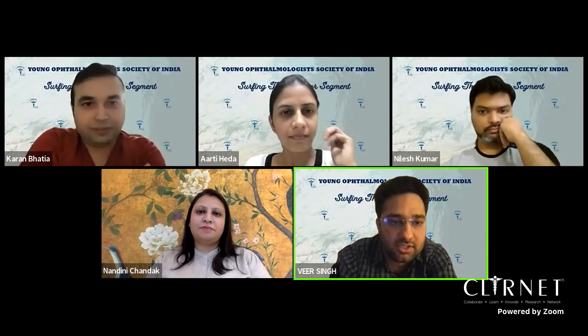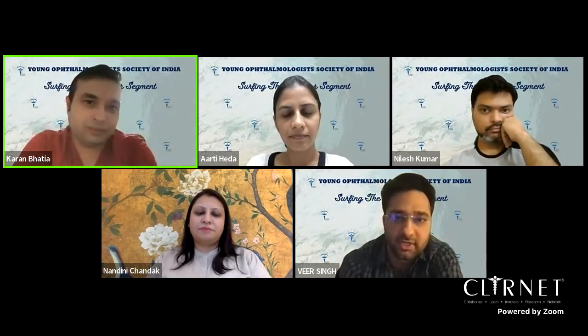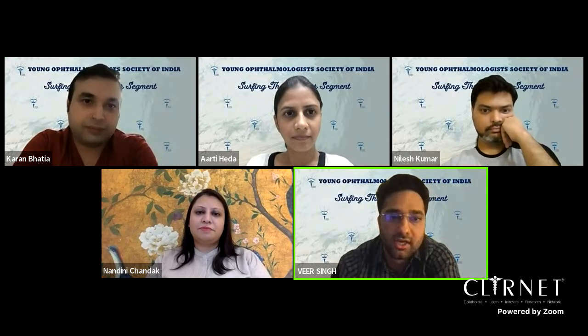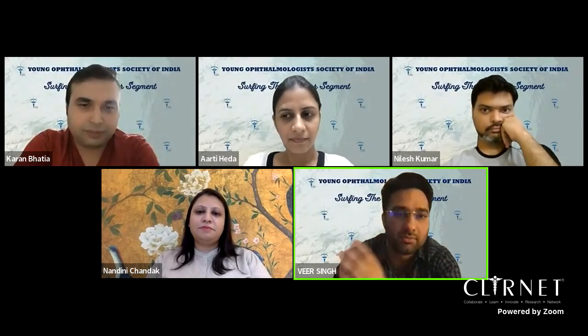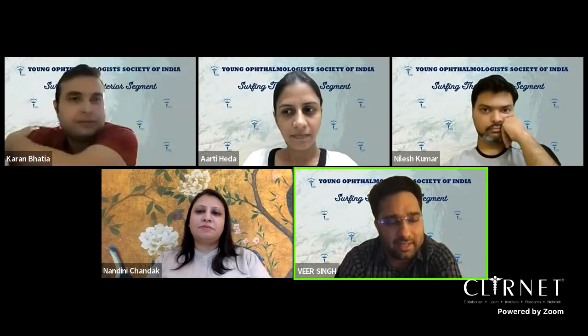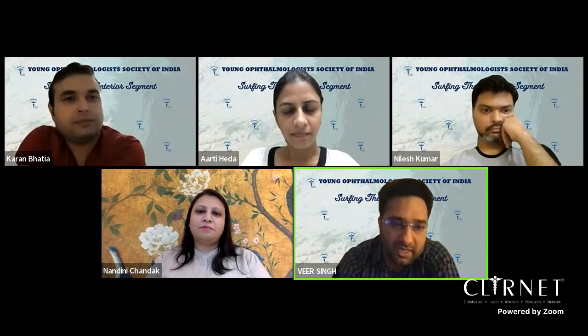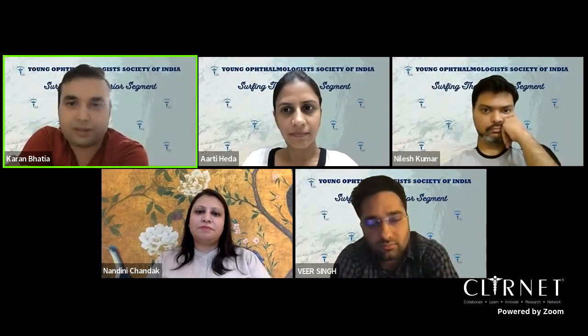Yeah. So basically, even all anterior segment surgeons are supposed to handle cases of malignant glaucoma as well, right? So what do you do? You put an AC maintainer or an infusion in the AC, and then do an anterior vitrectomy through a 3 mm pars plana incision. So I think that's a very reasonable thing, and that in fact maintains the anterior segment integrity even better. Yes.